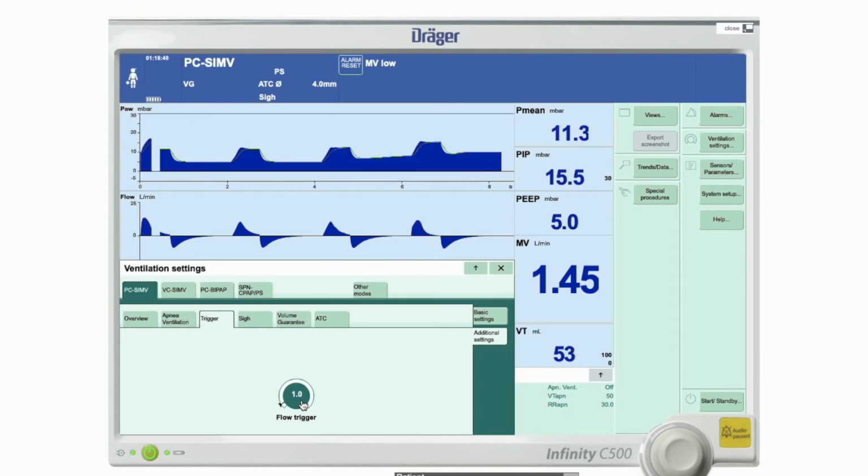That can also happen if there's a problem with rainout or fluid in the ventilator circuit. So if you notice auto-triggering, usually you get quite a few breaths at the same time. And the baby will be quite upset by it. You need to look at the sensitivity of the flow trigger and whether or not you need to increase it.